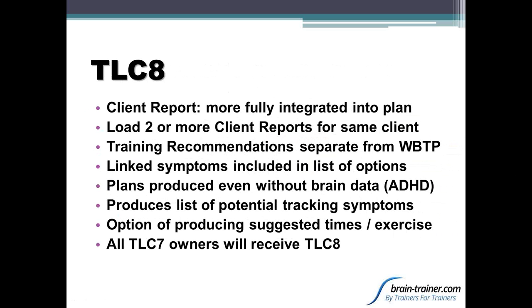And there will be the ability to produce a training plan even without recording EEG, particularly if you're working with children who are 5 or 6 or 7 years old and hyperactive. It's a real pain even to do 15 minutes of recording because they simply can't sit still.